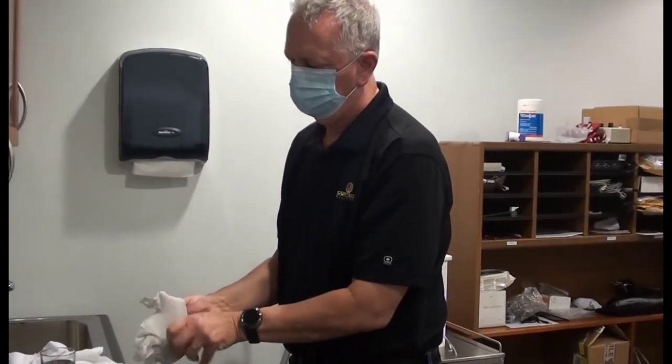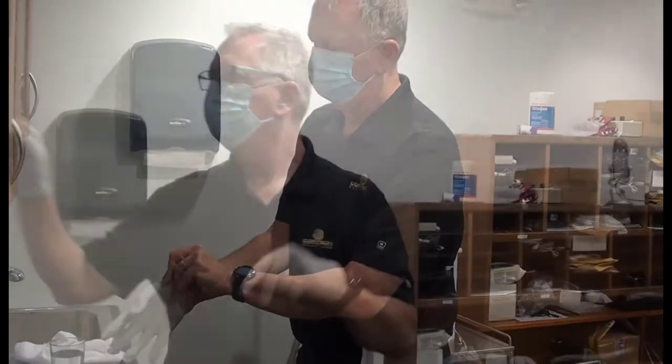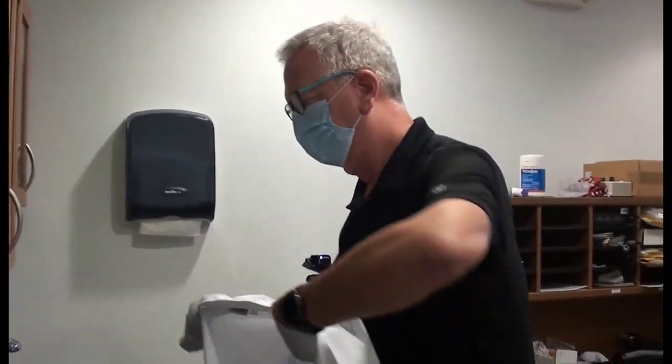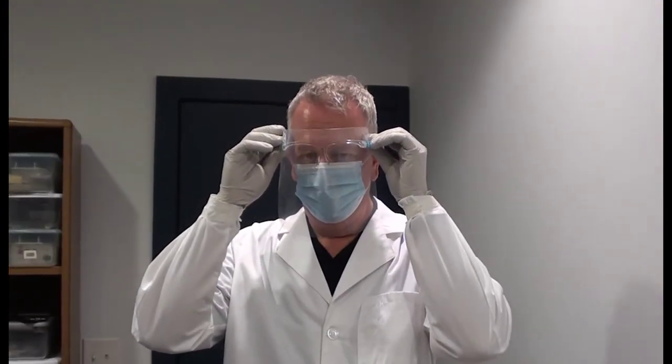When the participant arrives, you should be ready to go, having prepared your recording environment and supplies, but also wearing your PPE. The more prepared you are, the more you will be able to focus on your participant's needs.